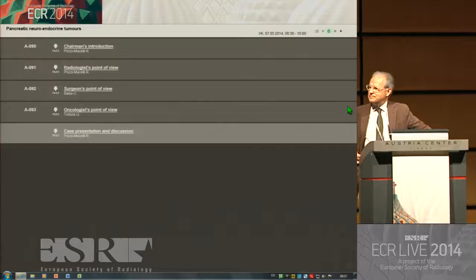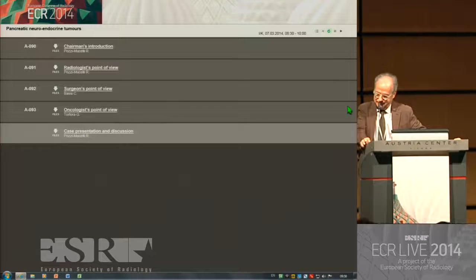Because it is possible to separate the organization of the tissue due to neoangiogenesis, and therefore there are areas characterized by a great amount of vessels, and also areas characterized by a completely different behavior.